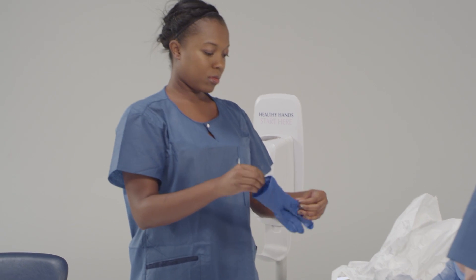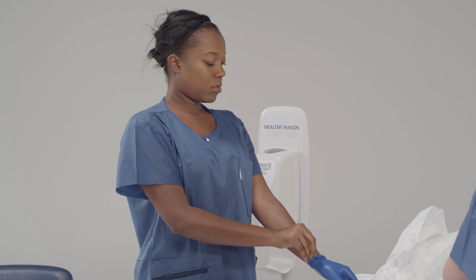Now we're going to put on our first pair of gloves. Do this as you normally would — it does not need to be done in a sterile fashion. Make sure that the cuffs of the gloves go as far up your arm as possible.